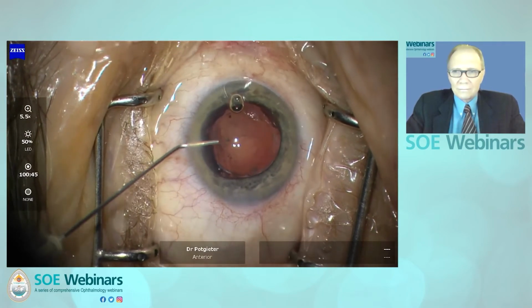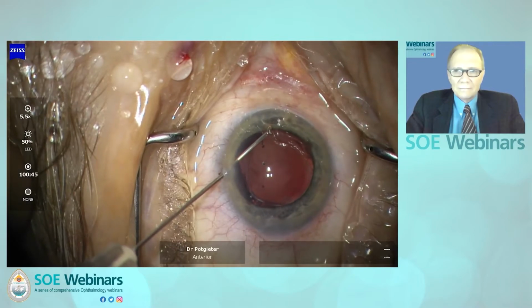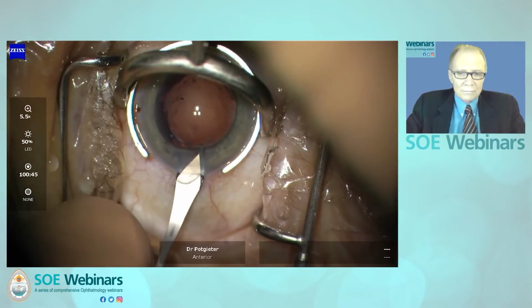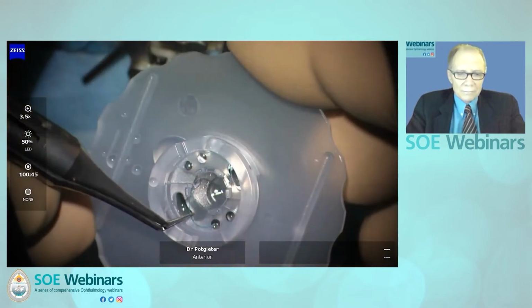The air bubble was removed from the anterior chamber through the side port to enhance visualization of the structures. Since we planned to utilize forceps in placing the IOL, the internal aspect of the main incision was enlarged to allow stretching of the wound.